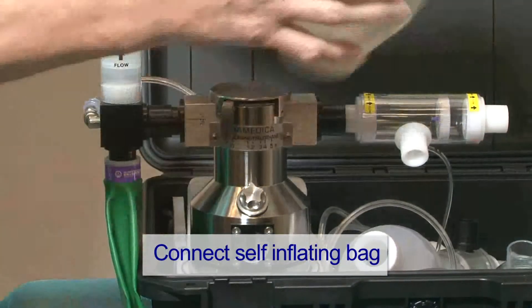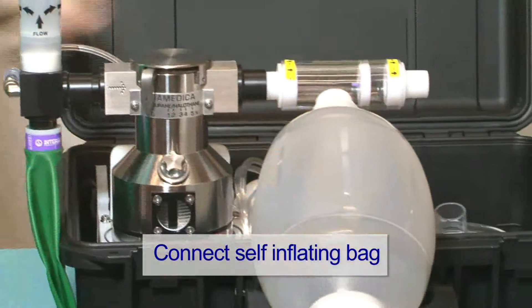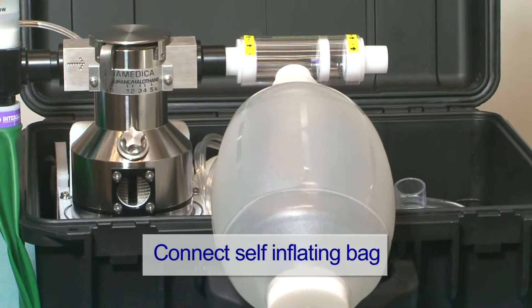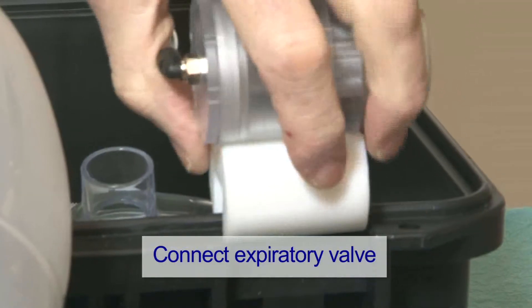Connect the self-inflating bag to the front of the clear valve section. Connect the expiratory side of the valve to the case.